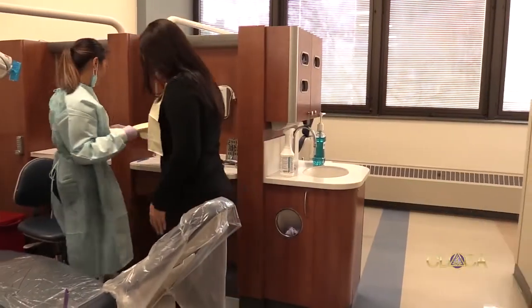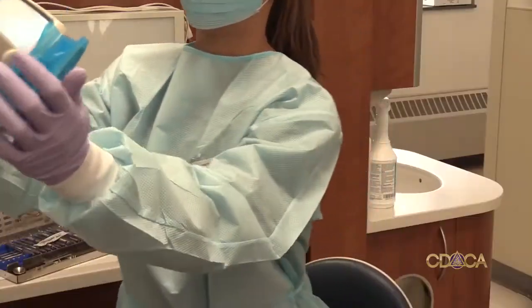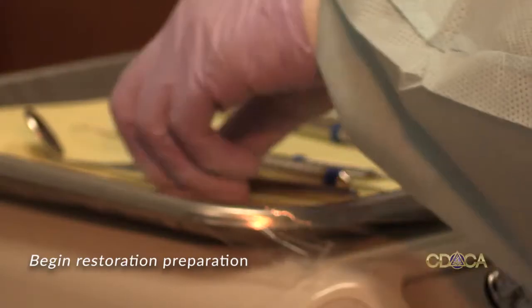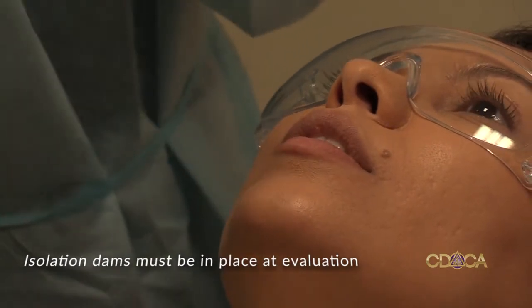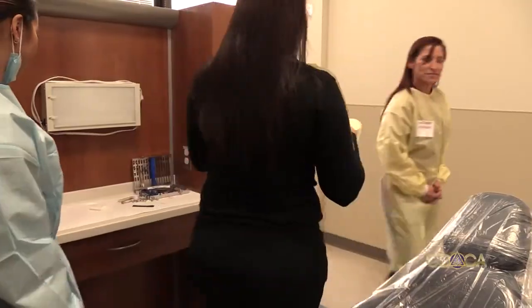The CFE will let you know if your lesion is approved. Now you may begin treatment. Prepare the tooth to acceptable dimensions. If the tooth needs no other modifications, make sure an isolation dam has been placed. Call over a CFE and they will request a runner to take your patient to the evaluation station.